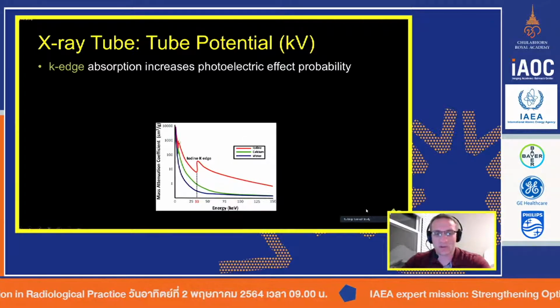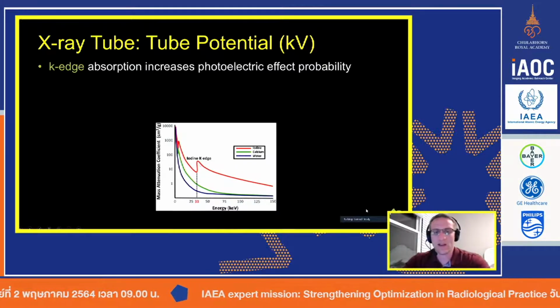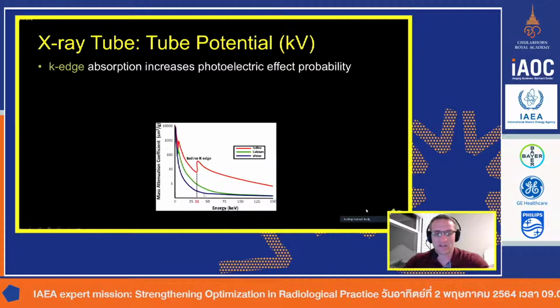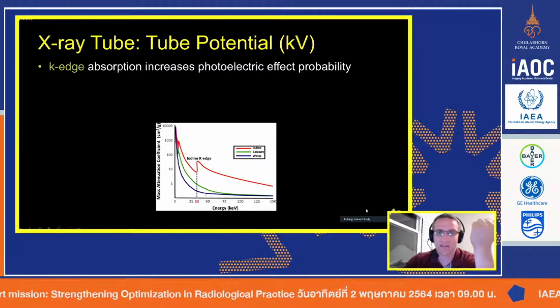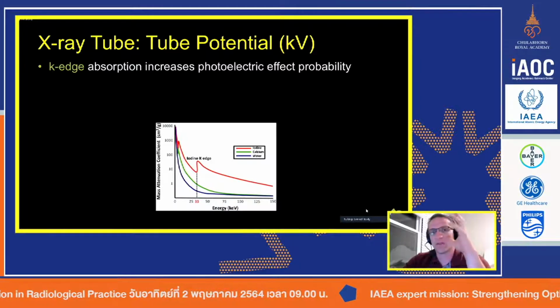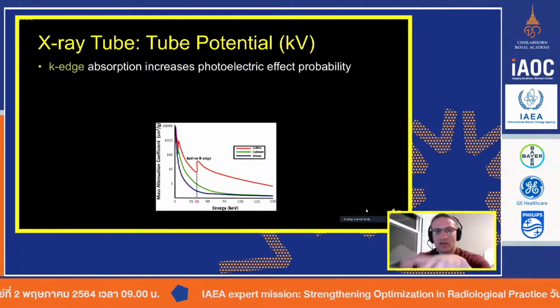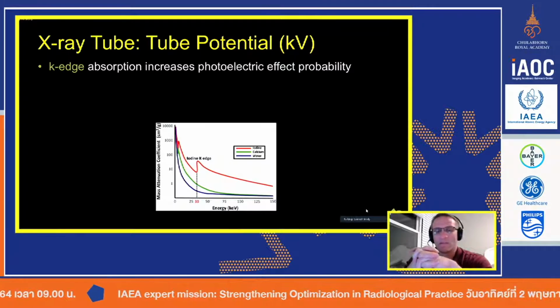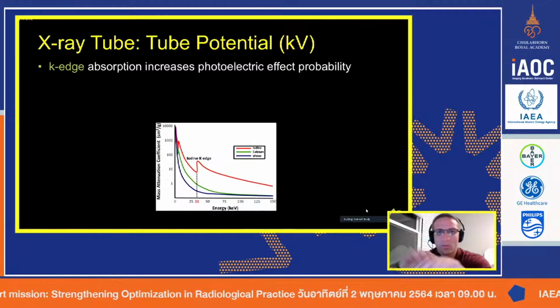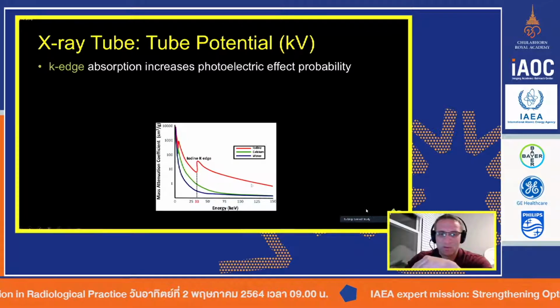And that is why we almost always, especially in CT, inject intravenous iodine. And that's because you can see this iodine curve really is much, much higher than the blue curve, the soft tissue. And so when you do IV contrast, and obviously we don't do that in X-ray, we may do a barium, we might do an oral contrast, in which case we're going to then coat the colon, and that will give us a better appreciation of the outline of the colon and the wall and the edges of the colon. But it's the same principle here as we're doing with this iodine.